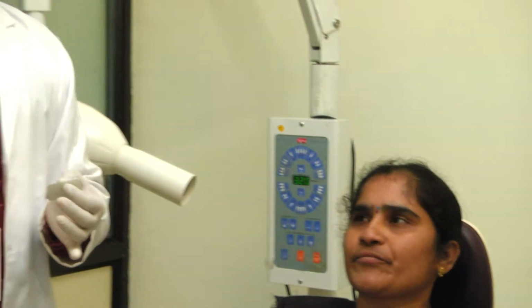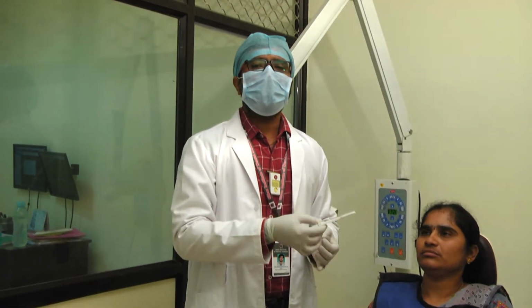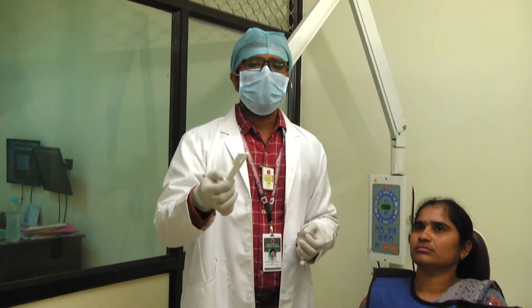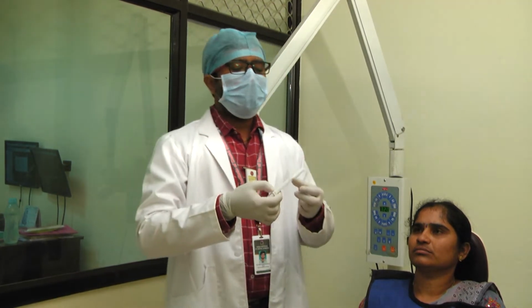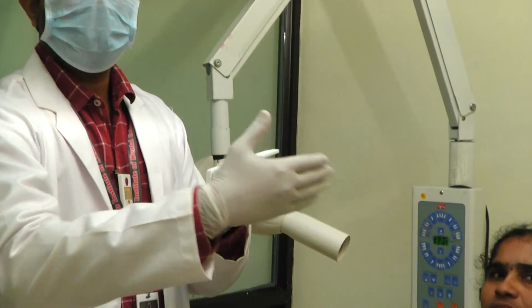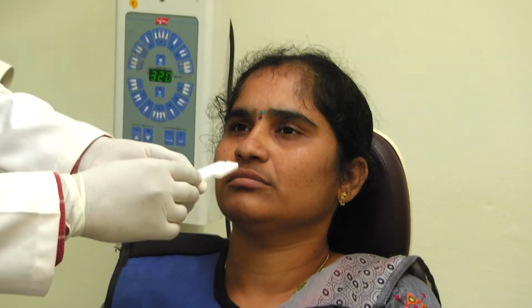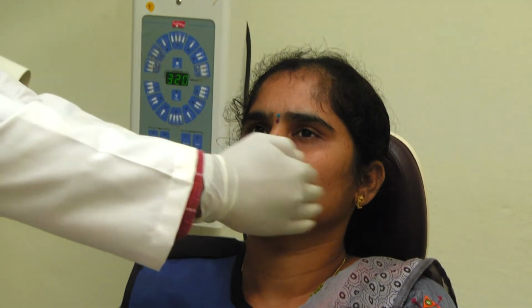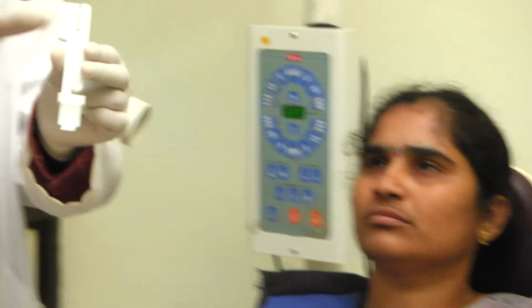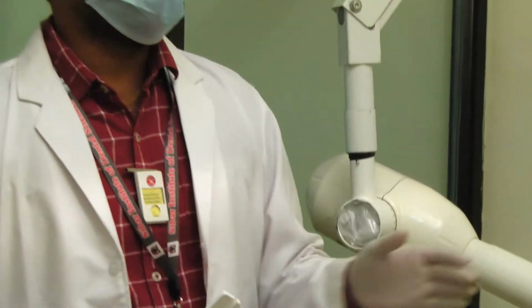And this is the film holding device, which is called a snap array, which is used for the bisecting angle technique. When you are using this snap array instrument, always make sure the broader surface is towards the buccal surface. Whether you are using it on the left side or the right side, the broader surface should be towards the buccal surface, so that the patient will bite on this occlusal table. So these are the fundamental rules to be followed.